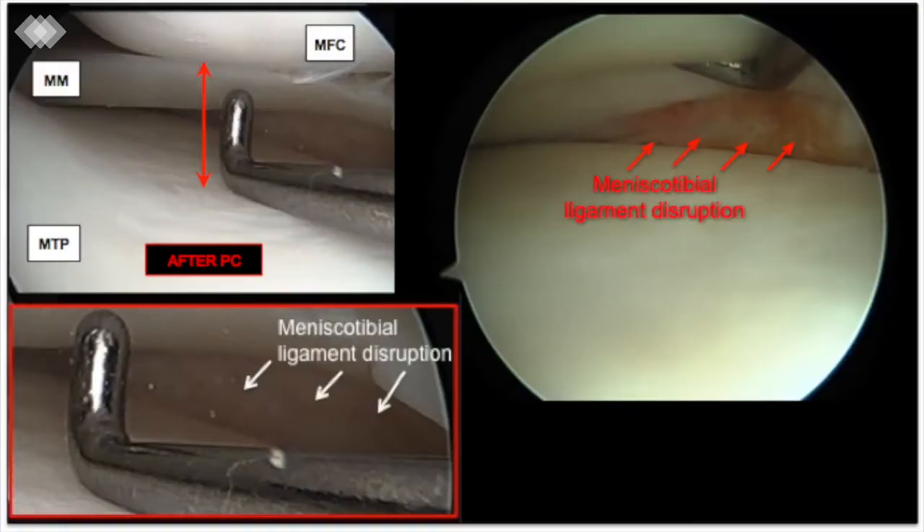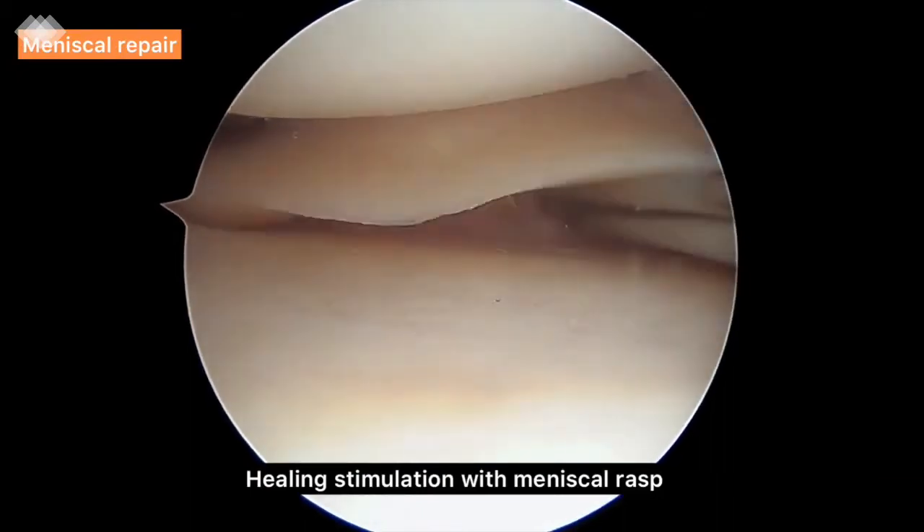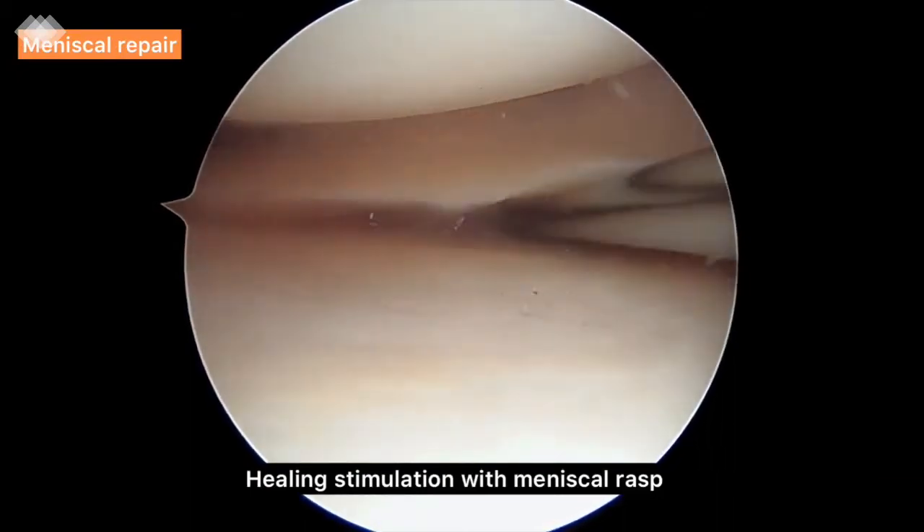The meniscal tibial ligament tear is clearly exposed when approaching the optic towards the posterior part under the meniscus. For the suture repair, we keep the same valgus position. A meniscal rasp is used to abrade both sides of the tear to stimulate a healing response. Before introducing the repair device, we curve the flexible needle.